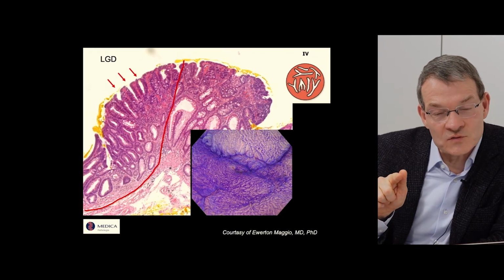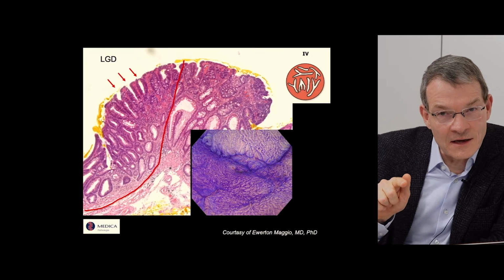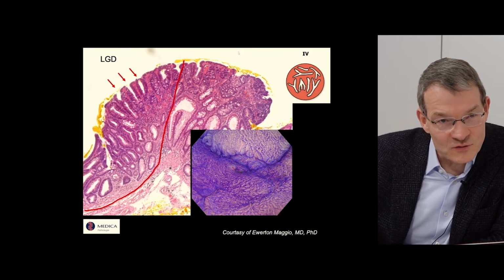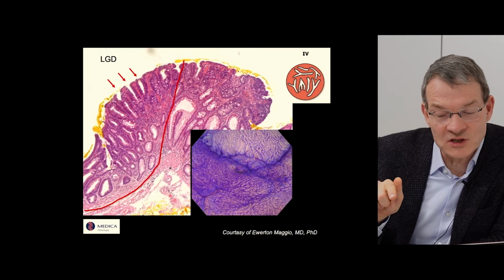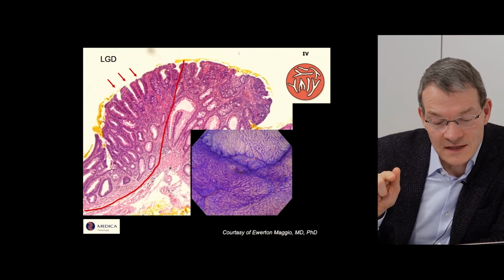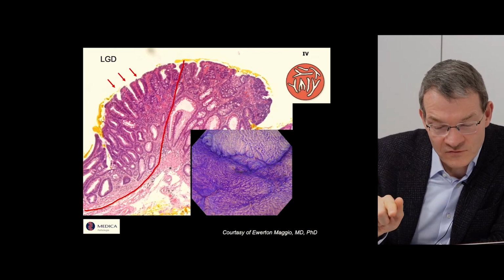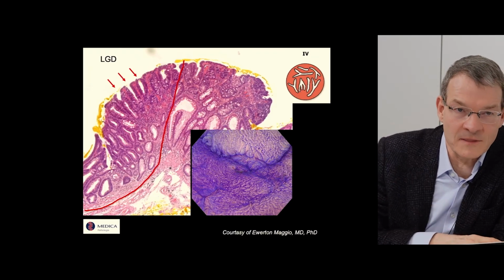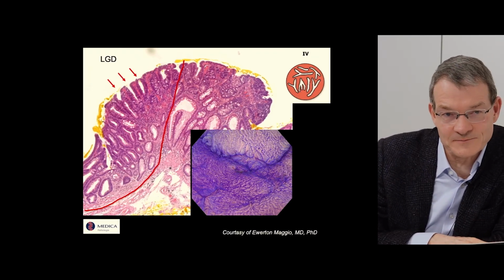And to conclude this again, JNET doesn't mean that we don't need Kudo. And especially in such lesions with 2B JNET, we should also perform an assessment of the surface pattern.